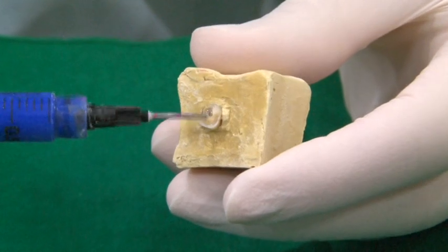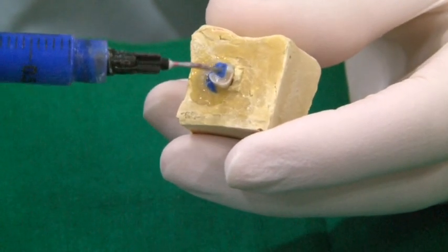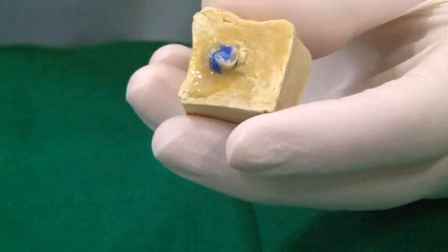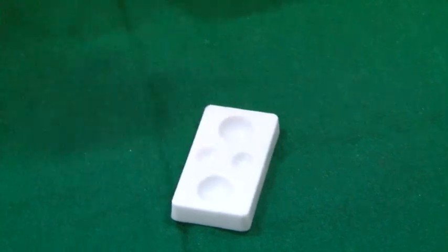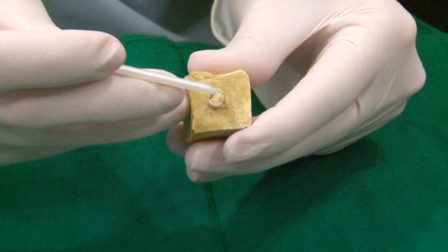The post space and the tooth is etched with 37% phosphoric acid. The etchant is placed for 10 seconds and then rinsed. Luxa Bond Total Etch is a dual curing adhesive system that comes with a pre-bond and a Bond A and B.